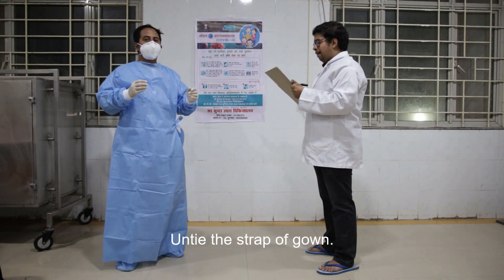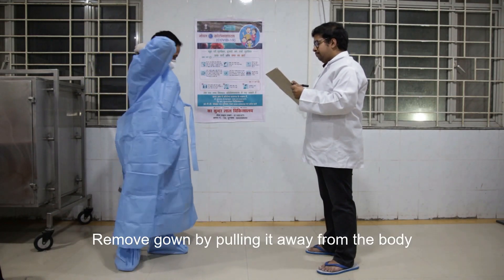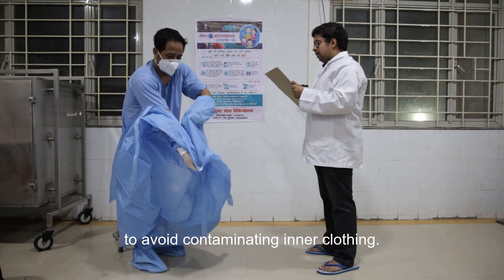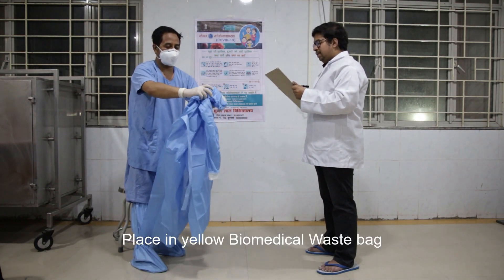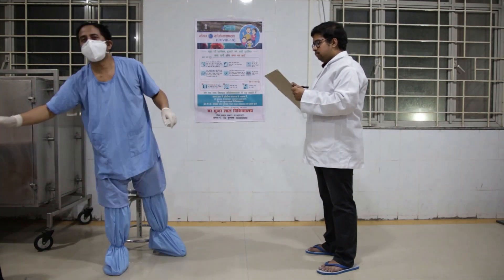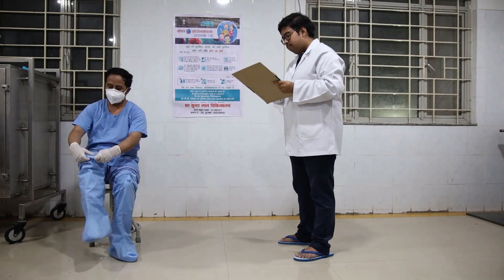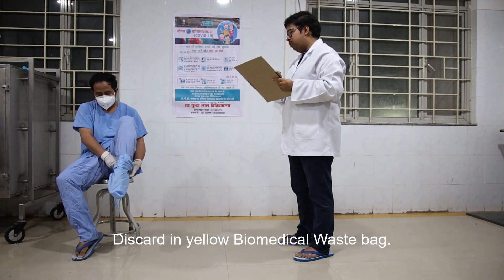Untie the straps of the gown. Remove the gown by pulling it away from the body, rolling it inside out, being careful to avoid contaminating inner clothing. Place in the yellow biomedical waste bin. Remove shoe covers while sitting on the designated stool and discard in the yellow biomedical waste bin.